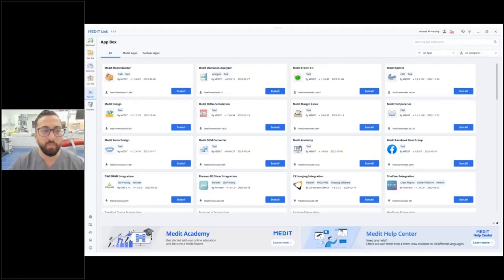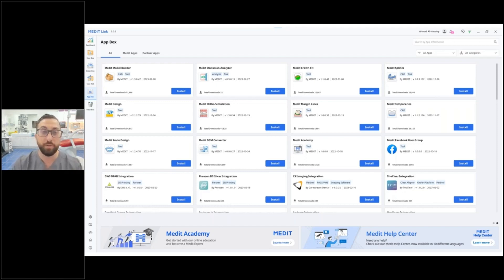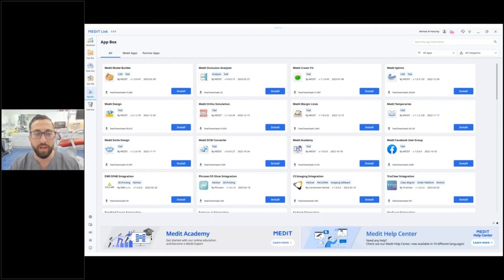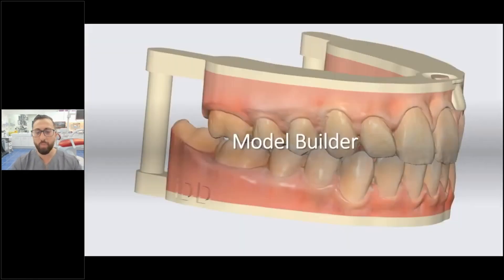What makes Medit so special is the Medit apps, and how you access them is through the App Box in their software. As you can see, there's just a ton of apps here. I wanted to go over some of the key ones that really made a change in my practice — from an occlusal analyzer, Medit Design, orthodontic simulation, Medit temporary splints, and now we have Clinic CAD.